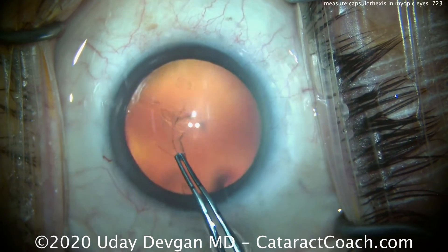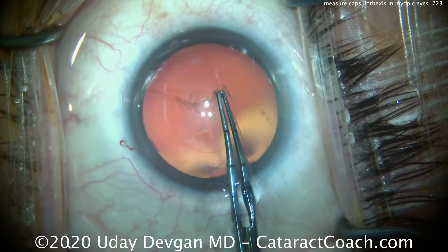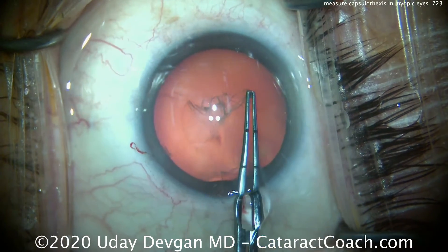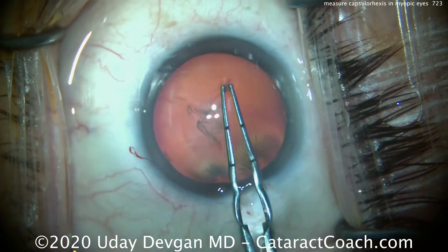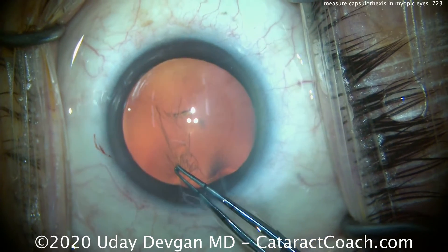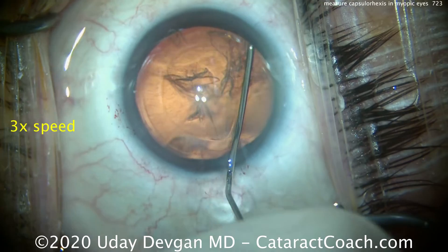I want to make a 5 to 5.5 mm capsulorhexis. Our forceps are marked off at 2.5 and 5 mm from the tip. There are many brands of forceps that have this type of marking. You can even mark your own — use a disposable steel keratome and, under the microscope, make scratches or etch a mark at the 2.5 and 5 mm points. If you want to know which forceps I'm using, it's on my CataractCoach website — click on About Dr. Devgan and then Instruments. So there's the capsulorhexis.